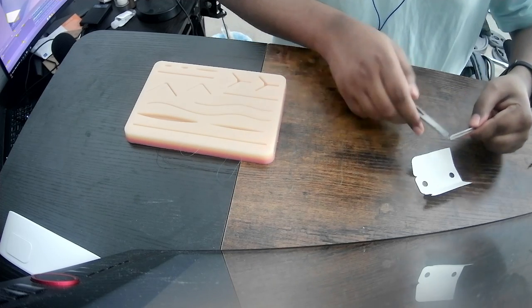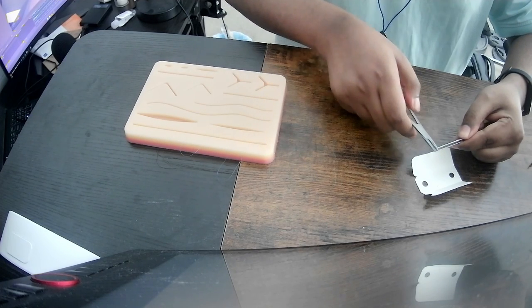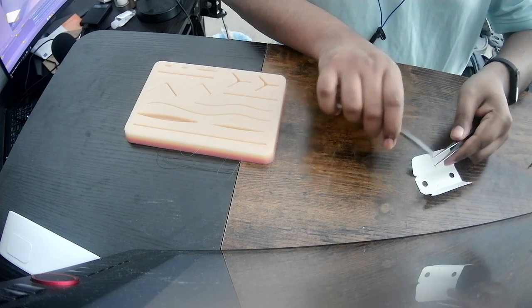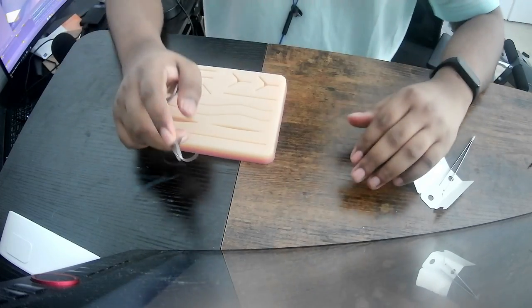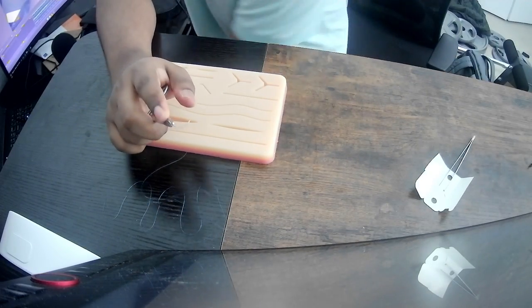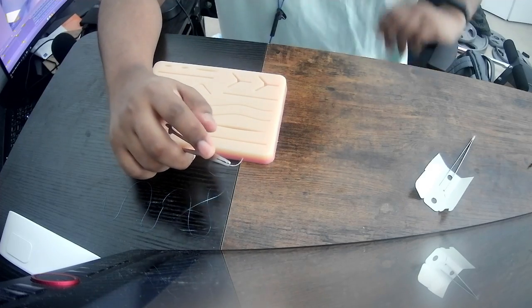Let's try that again. Unlock. Needle is in place. Very secure. I choose my location and I lock. Okay, very good. Making good progress. Gotta be mindful, this is a real needle, by the way. Be comfortable doing that before you start.